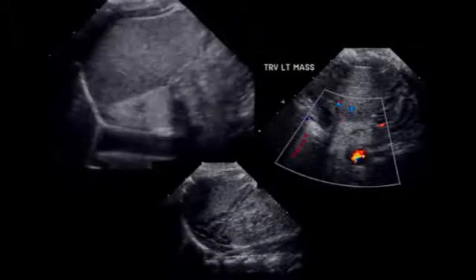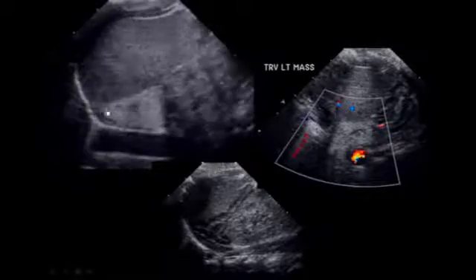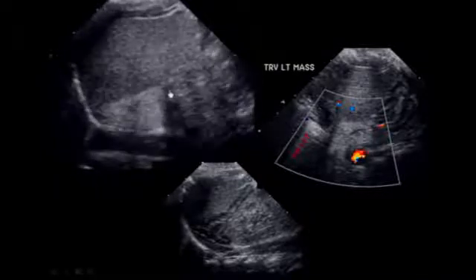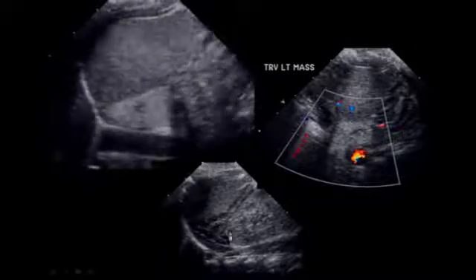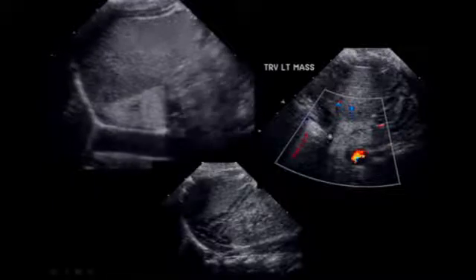Another fetus, this is a neonate. Again, we're back in the NICU, and you can see this lesion that was picked up behind the left lobe of the liver. Very discrete triangular lesion. What are we going to do? Let's go over and make sure that we have a beautiful adrenal gland and a beautiful kidney separate from the lesion, which is seen right here.